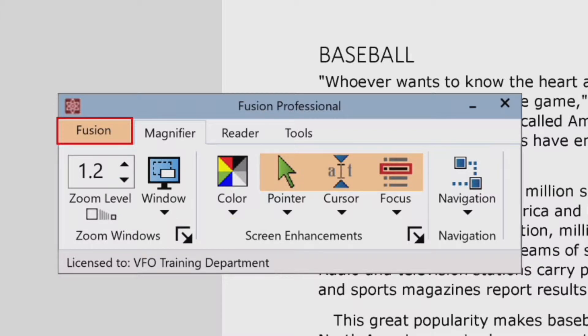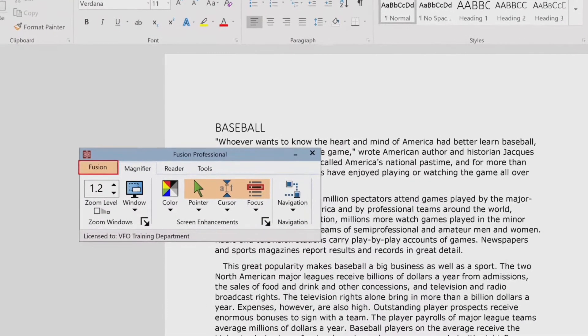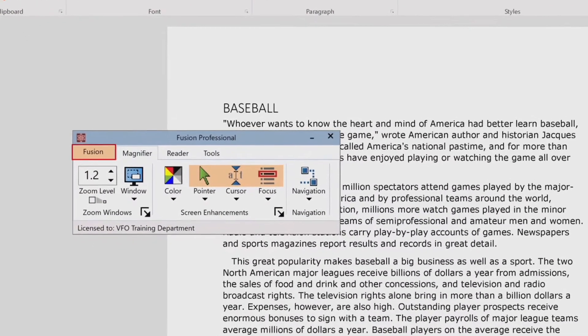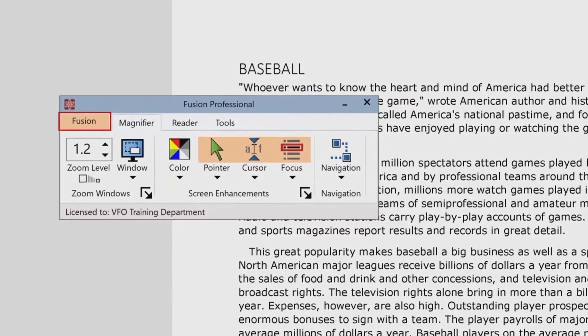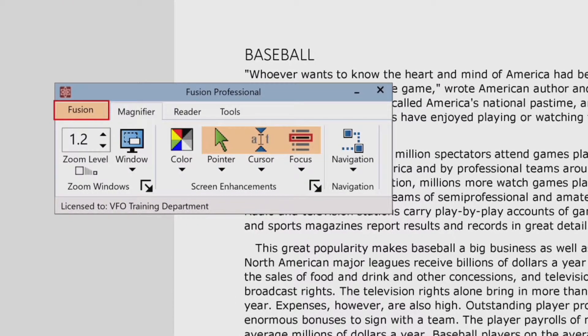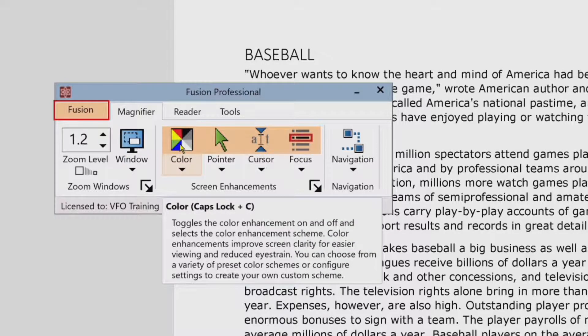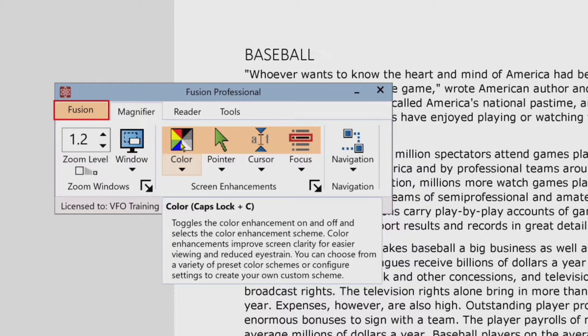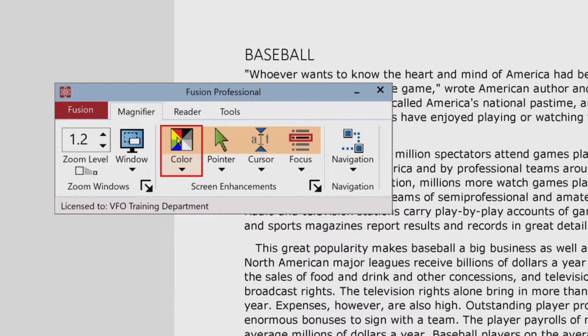To toggle the color enhancements on and off, do one of the following. On the magnifier toolbar tab, select the color button. Color split button, collapse not checked. Color enhancements enabled. Color enhancements disabled.